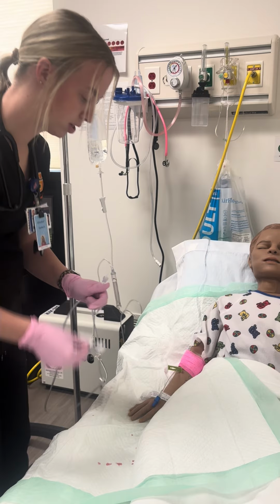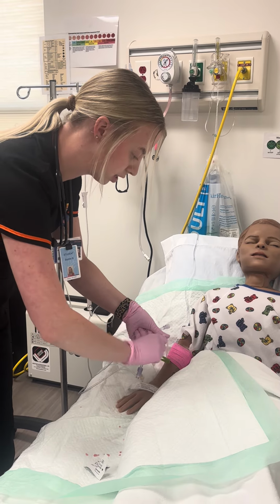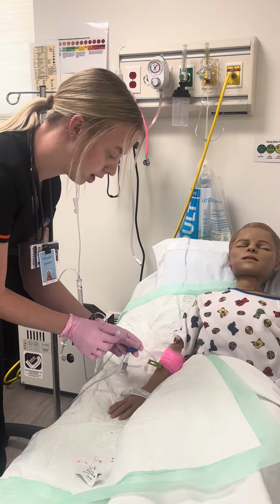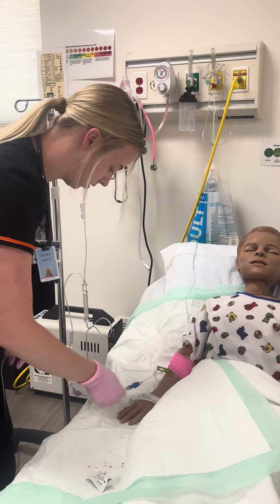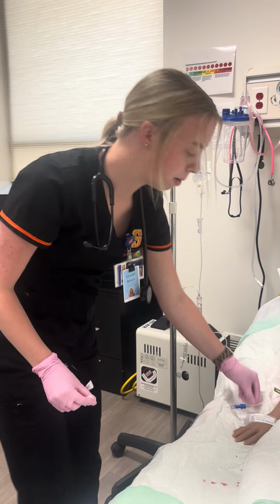I'm going to vigorously clean for 30 seconds again to make sure that this is extremely clean. And then since this part hasn't been hooked up to anything, we can immediately hook it up. Once again, ignore my shakiness. Okay, now that that is hooked up, we can go get the blood.